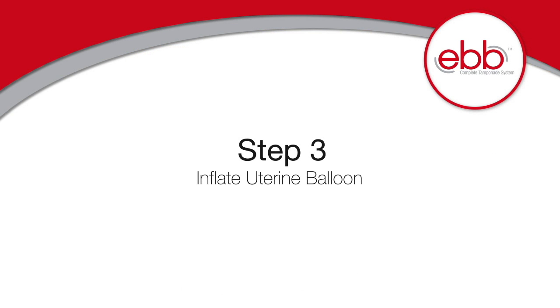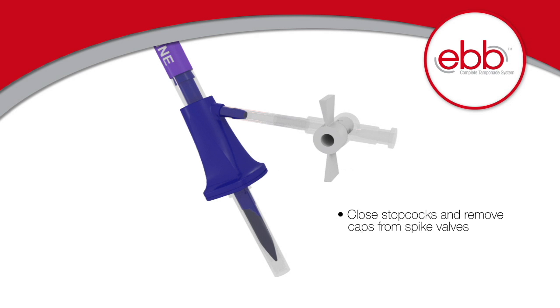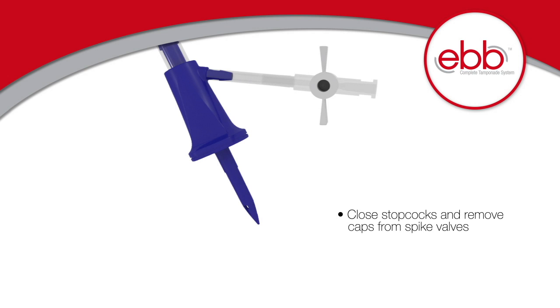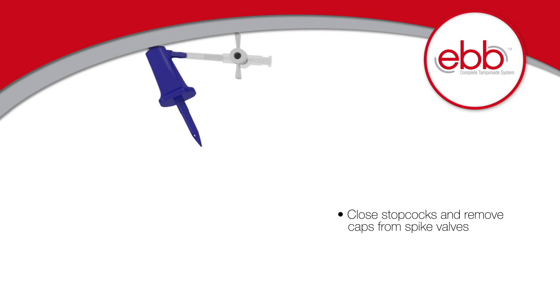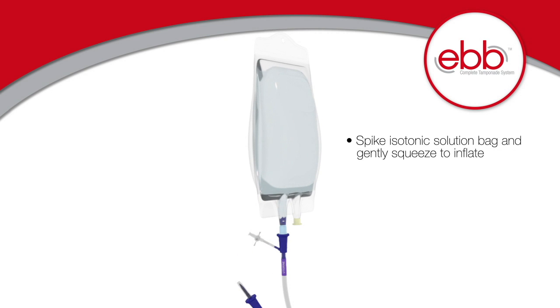Step 3: Inflate the uterine balloon. To inflate, ensure the stopcocks are closed and remove the cap from the spike valve. Spike an IV bag, or any kind of isotonic solution, and gently squeeze. You can also fill using the stopcocks and syringe if you desire.